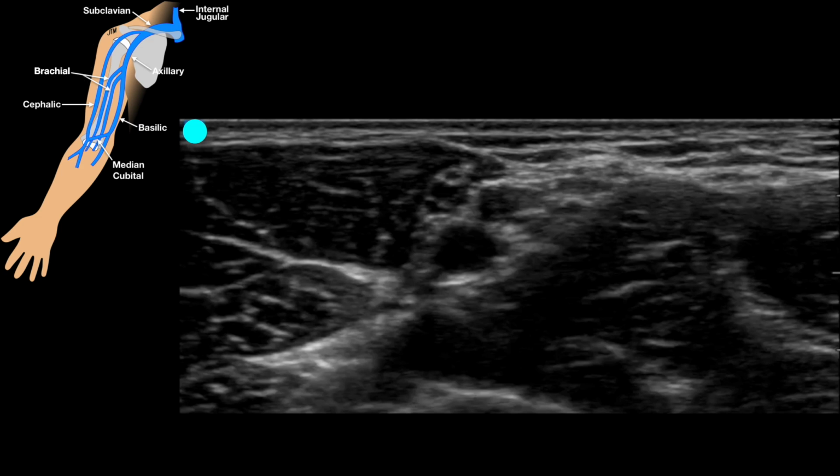Okay, so here we can see in this patient, so this arm is a different arm or extremity, and so we would look over in here for a basilic, and we don't see anything. There's no basilic to obtain access in, and so instead we're now going to look here at the vein. Here's our artery, and once again our nerves are not quite as obvious.